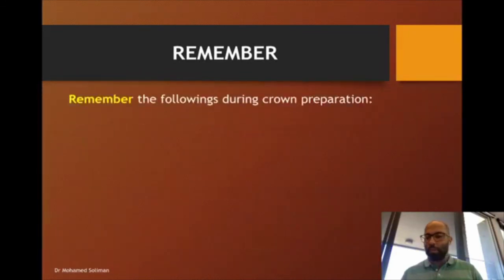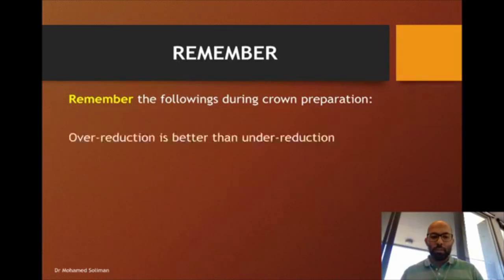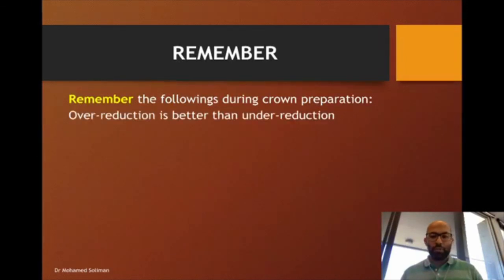Just we'll go into some points to remember during crown preparation. Remember that over-reduction is usually better than under-reduction, and this is according to the criteria of the ADC, because they put a wide range for the over-reduction. However, if it is under-reduction, it will go straight into the borderline because they will consider it an insufficient amount of reduction of the tooth.